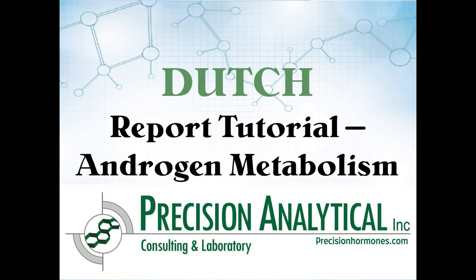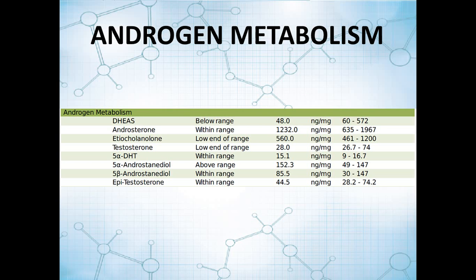In this video, we're going to be talking about our dried urine testing for comprehensive hormones, our DUTCH testing. We're going to be talking specifically about the androgen portion of the profile. So for the androgens, you can see the hormones that were tested listed here. And then, of course, on this page, we're just showing whether they're within range and the numbers and the ranges.